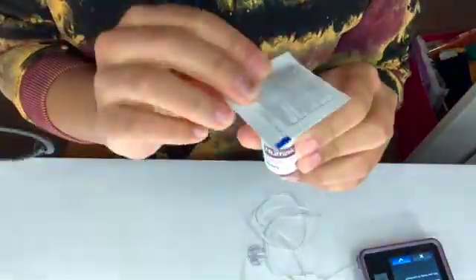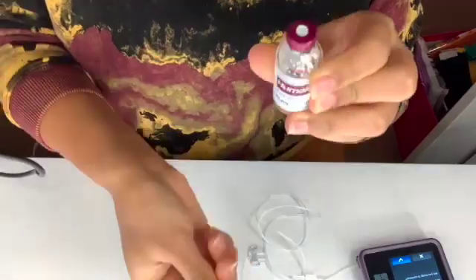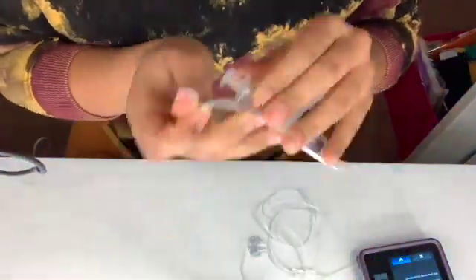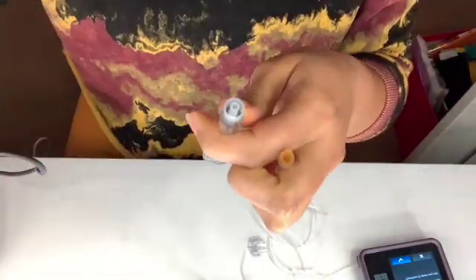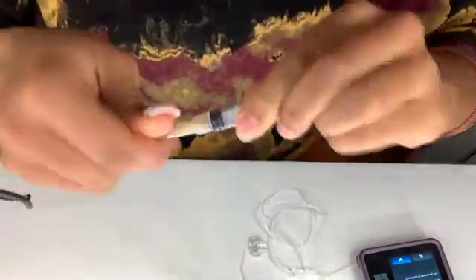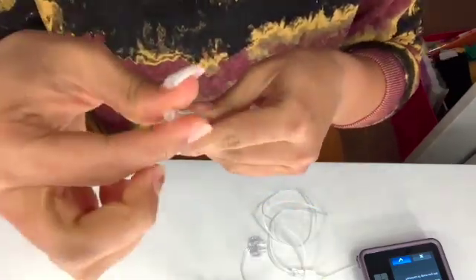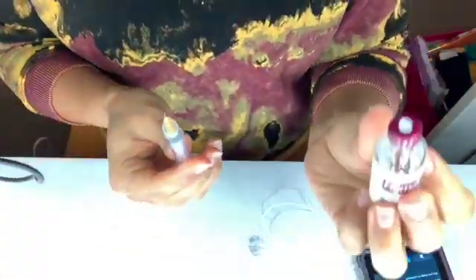If you already have a vial of insulin open, you should wipe the top, but since this is brand new, I don't really have to wipe the top. Then you're going to take your syringe and open that, and then open the needle, and screw them together like such. Then just give it a few little pumps to get the vacuum seal in there.